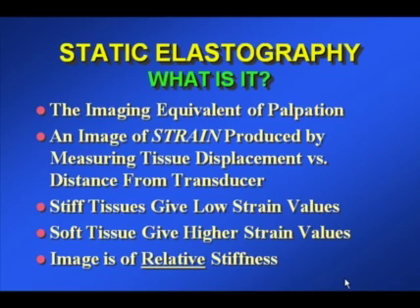The final image produced in a static elastogram is one of relative stiffness. It's a relative image very similar to an MRI, and thus it's very difficult to derive specific fixed values from within that image.